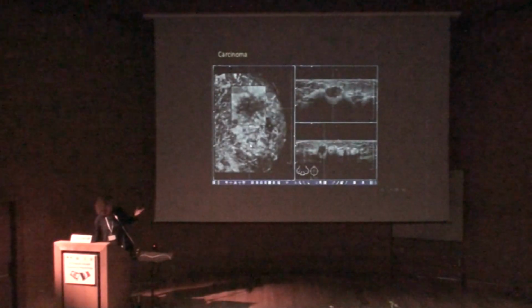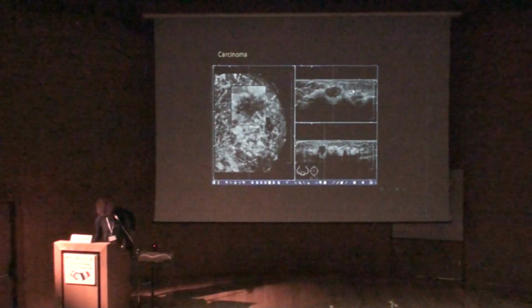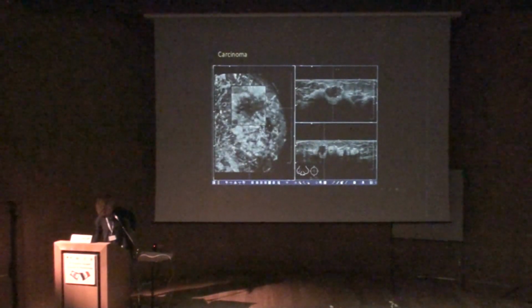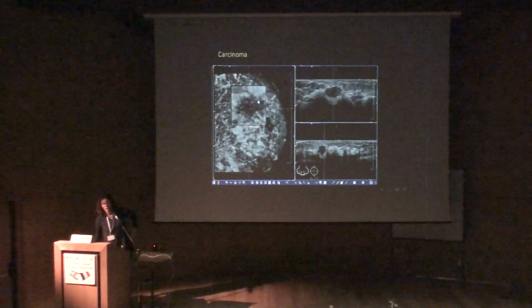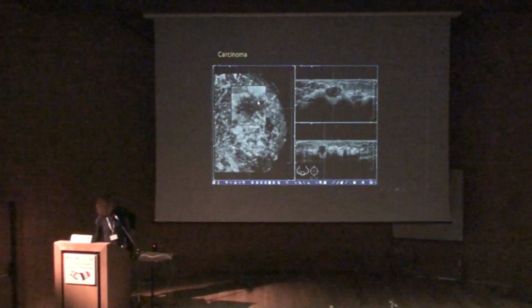This is how it looks. We have the axial normal image. Here we see the irregular mass. We see the 90 degrees image, and we see the coronal reconstruction. And here we can see a 3D coronal image with spiculation, very similar to the surgical view.